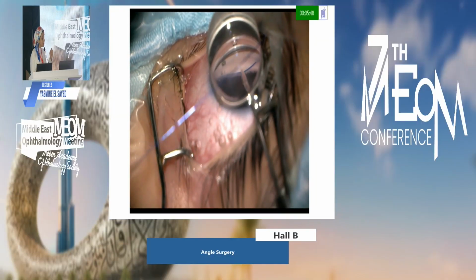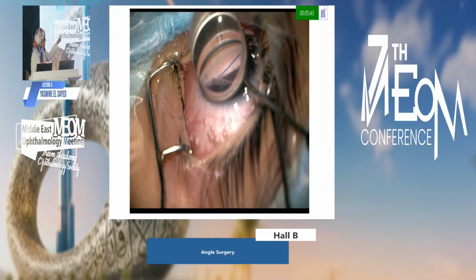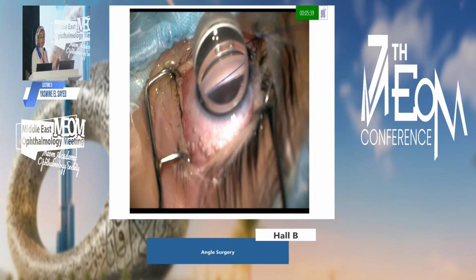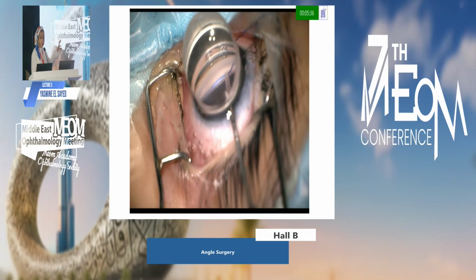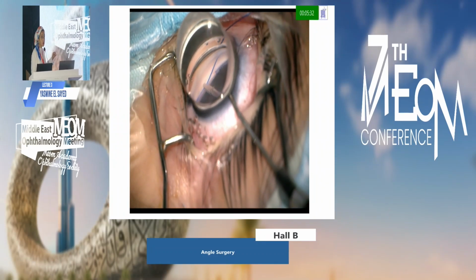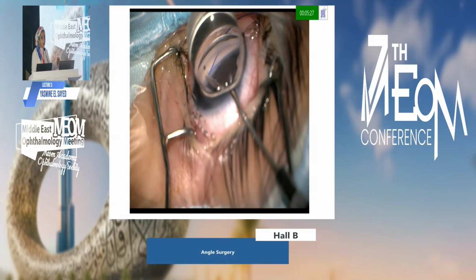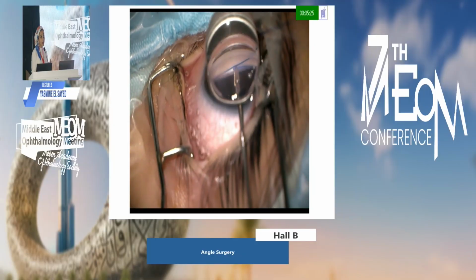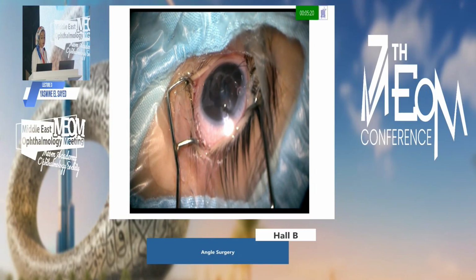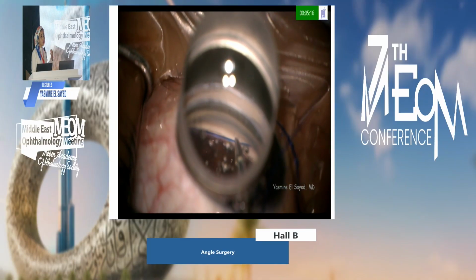At the same time, once you're in, whether in adults or peds, we need to make sure that the first passage of the suture or catheter is covered by the inner wall of the Schlemm's canal. It appears as the grayish tissue covering the suture. Once it goes through the first quadrant, it's very unlikely to separate from the Schlemm's canal. Usually it completes the incision in the blind spots you have around the limbus. If you follow it in the first quadrant and get it through that part, it's very unlikely to misdirect.